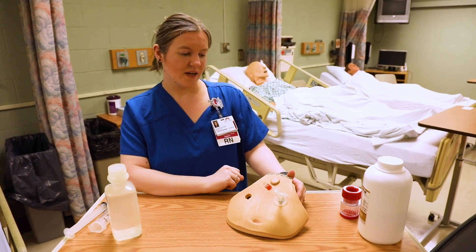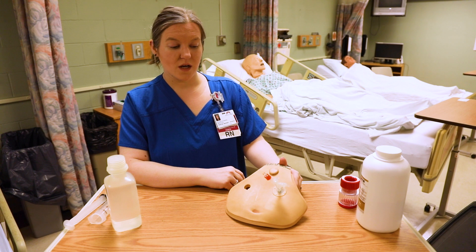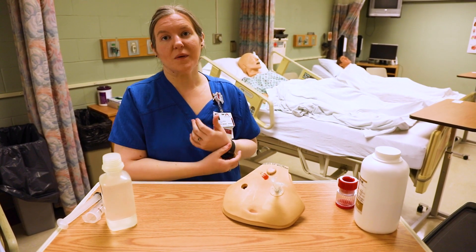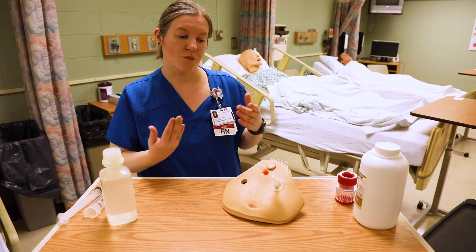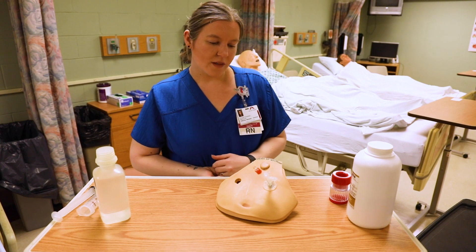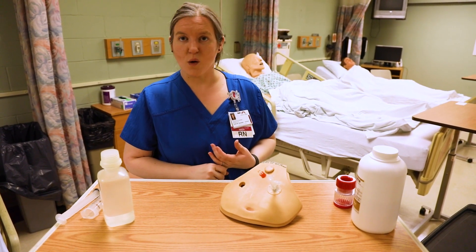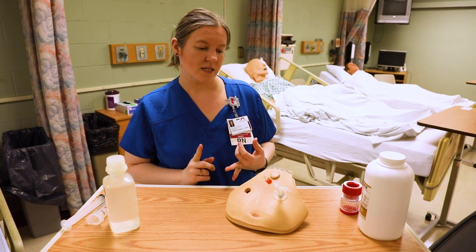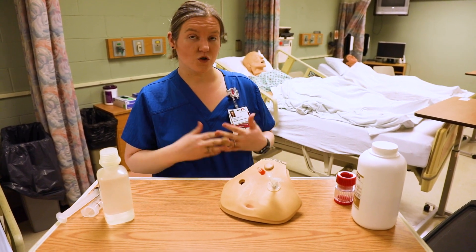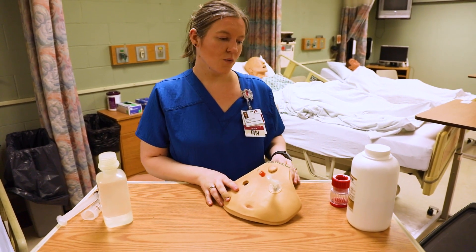I'm going to show you how to put medication through a PEG tube. This can also work through an NG tube — just make sure if you're putting it through an NG tube you stop suction, because if the person is hooked up to suction, it will pull the medication out. Also make sure that placement has been verified through whatever your facility requires, whether that be an air bolus, a pH screening, or potentially an X-ray.